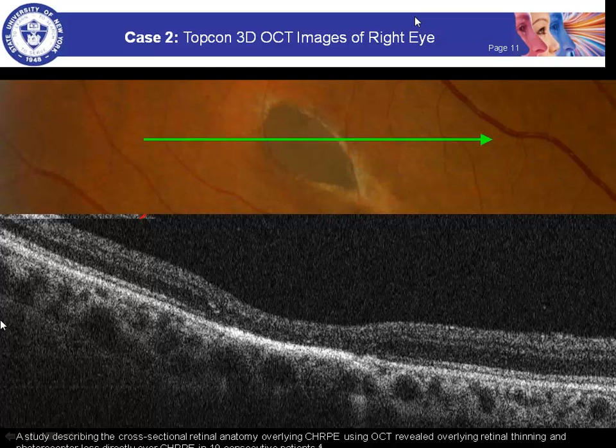So the first question is, how does OCT compare in early glaucoma detection compared to HRT or GDX? That's a very good question. If you're talking about the peripapillary measurement of the retinal nerve fiber layer, I think GDX generally does a better job. I think, in general, nerve fiber layer technology is better than HRT. Looking at the cup size, the number one reason that patients have large cups is that they have physiologic cups. So HRT virtually never makes a diagnosis on the first visit. You have to look at the patient over time. I still do all these procedures on all glaucoma patients that I see, both at SUNY and in private practice at the Eye Institute. I think the GDX is actually the best.